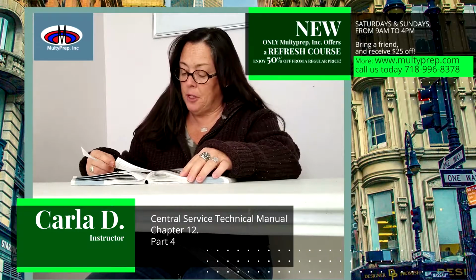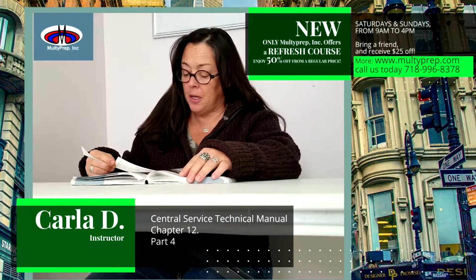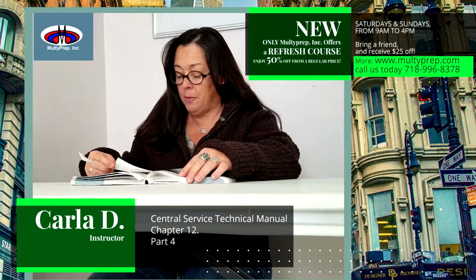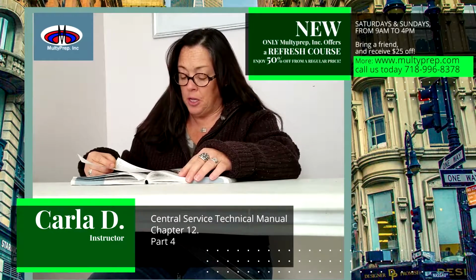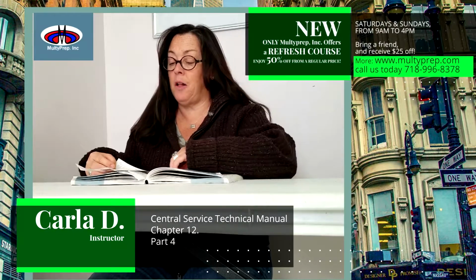The use of each packaging material has advantages and disadvantages. CS technicians must ensure that they select the type of packaging most suitable for the items being packaged and the type of sterilization selected. CS technicians can then begin preparing the package contents for packaging and the sterilization process to follow.